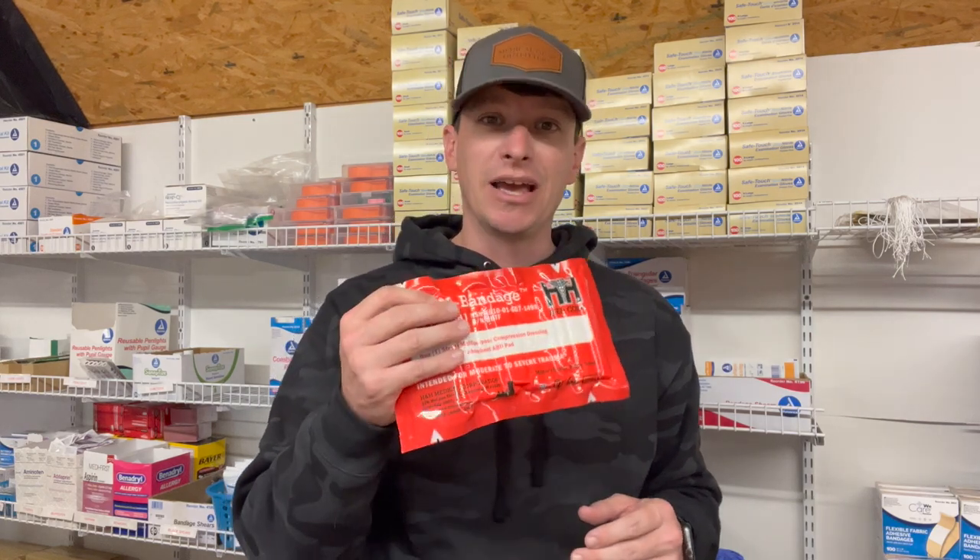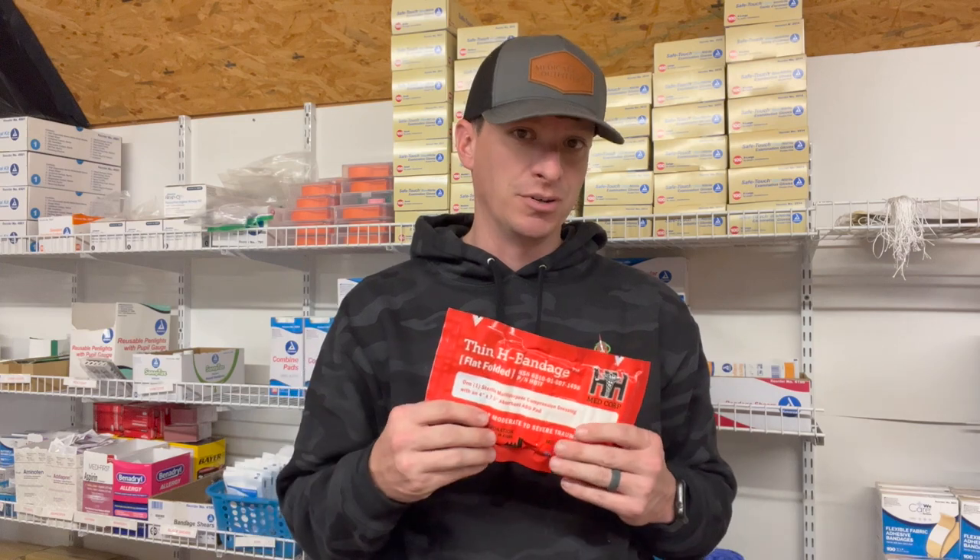Hey, welcome to another product review from Medical Gear Outfitters. This is the Thin H Bandage from H&H Medical. I did a full review on it over the Skinny Medic channel, but just kind of want to bring it to your attention over here on this video.